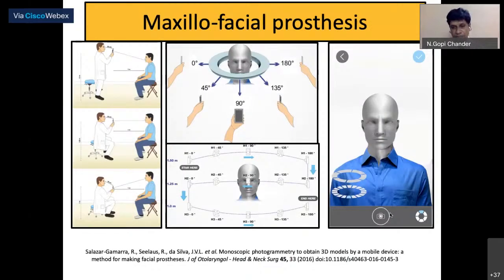The major change in fabricating maxillofacial prostheses comes with digital platforms. The conventional way is to make impressions of the face, in terms of a facial moulage. You consume a lot of material, a lot of technical support is required, and skill is required in making the impressions. Now it is made very simple. You capture images with your mobile phones. Forget about higher grade tech.